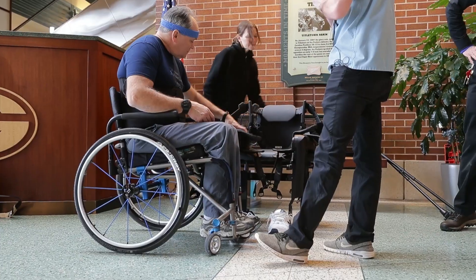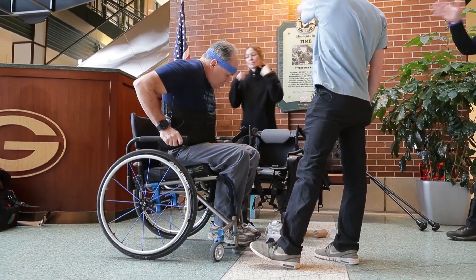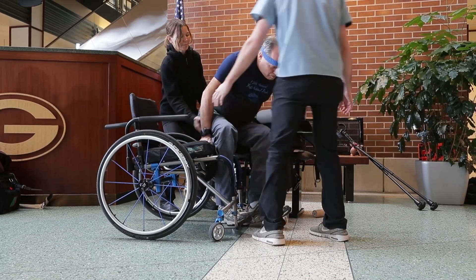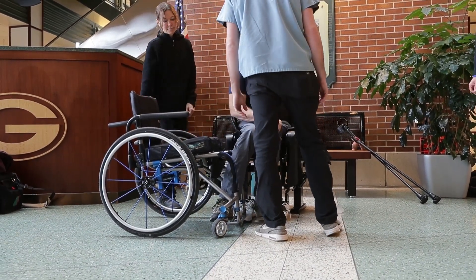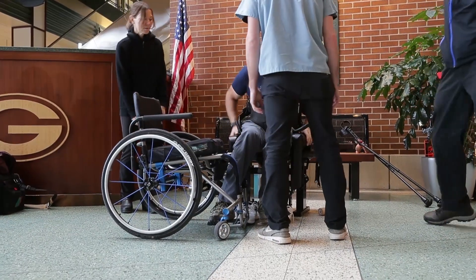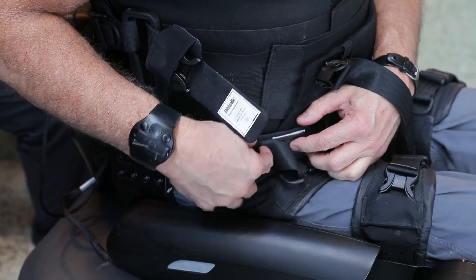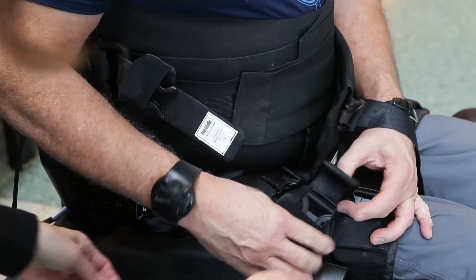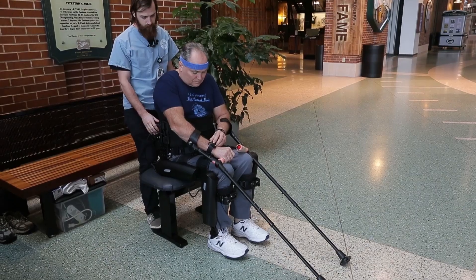With this study we basically want to see how useful these devices are in the community. We have a screening phase where they go through a lot of tests and measures, and then we do a training portion. But ideally the participant takes the device home for four months, and they get to use it in their community and at home. We really want to make sure that veterans are using them so we can get them what they need.